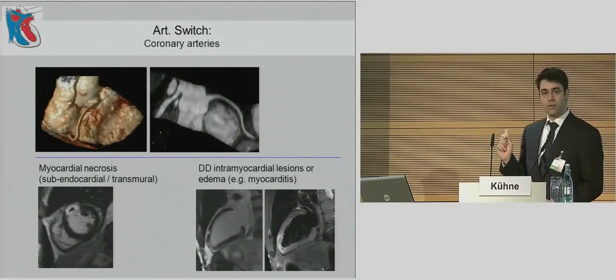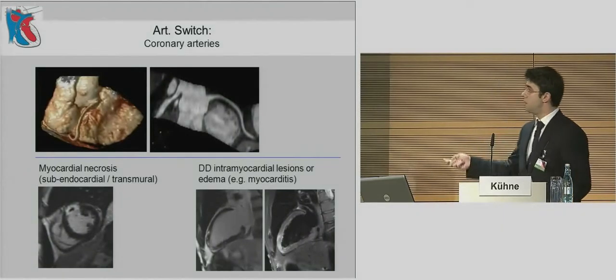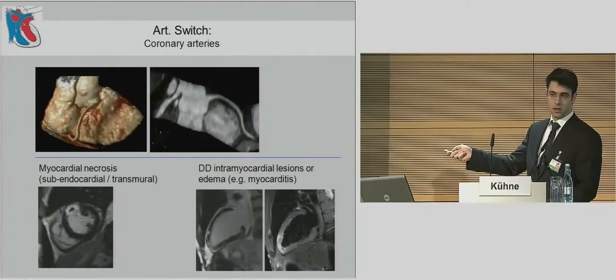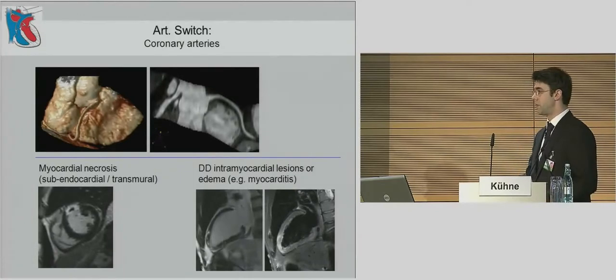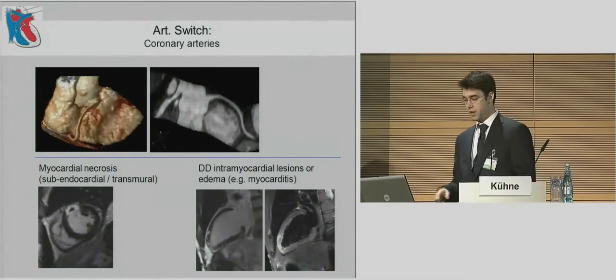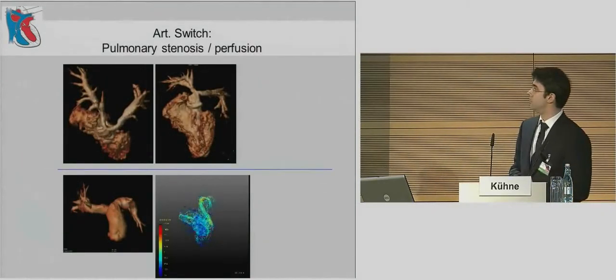The only issue I see where these methods might be valuable is in the early state, if there's an early presenter, and we show, okay, there has been an ischemic situation, so to assess whether the myocardium is viable, if we can expect some remodeling, if we should do something in the acute state. In the follow-up, I do not see, with these tools available in our days, many places to really give the patient a good option.